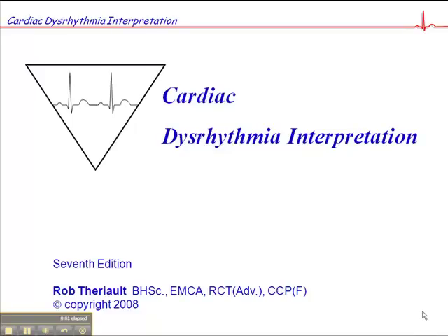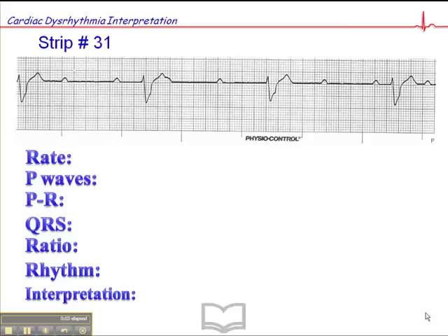Now we're on page 100, this is exercise 31, and we'll start with heart rate again, which is approximately 20. Let's see, we'll measure it out here.